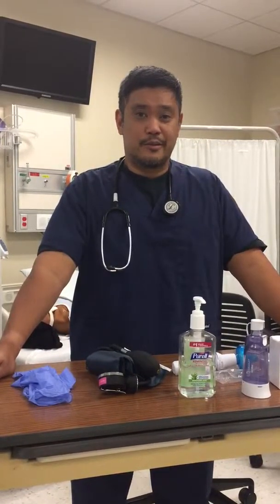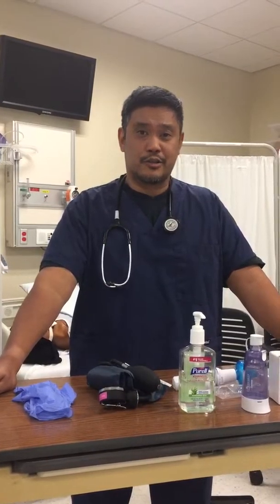Hi, my name is Richard, and I'm here to go over my metered dose inhaler competency. That's an MDI. In this particular case, before entering the patient's room, I will go ahead and check their chart. I'll be checking for their vital trends, their name and date of birth, physician's orders, anything that might impact the treatment, I will take note of.